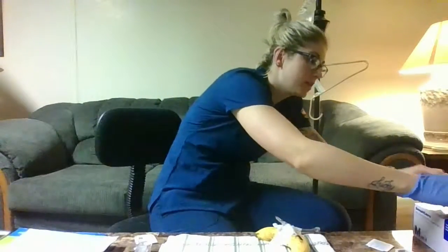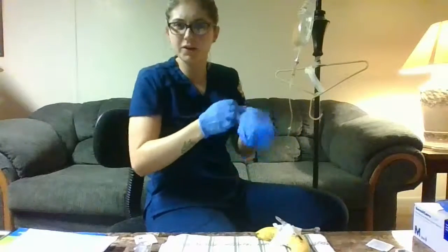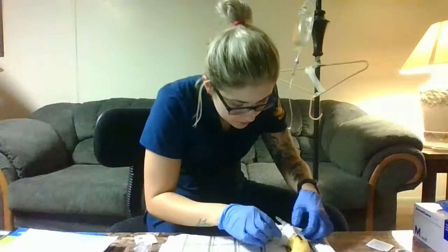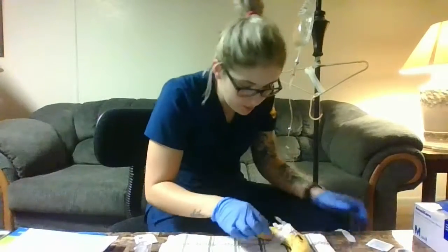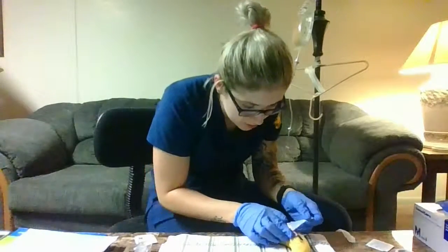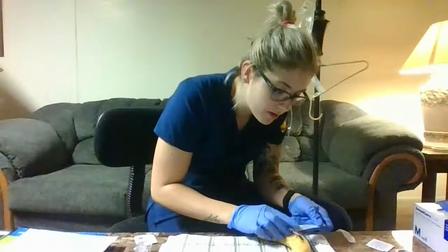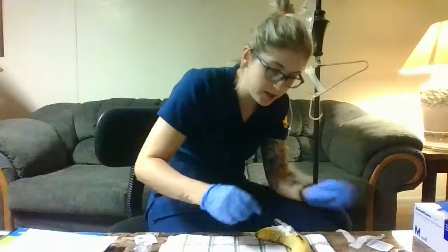Put some gloves on. Before touching anything around the IV, put some gloves on. We're going to remove that tape that we put on. And then we're going to expose the hub. So we're not removing the clear dressing. We're just removing the tape, so we can see the IV hub.